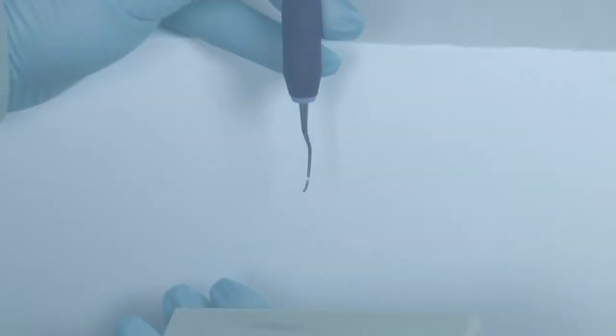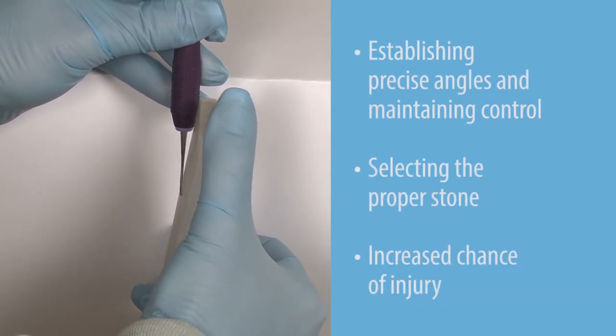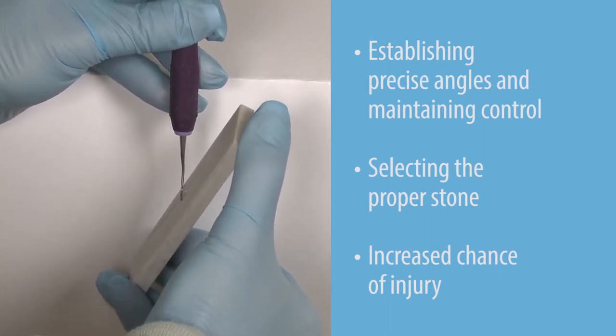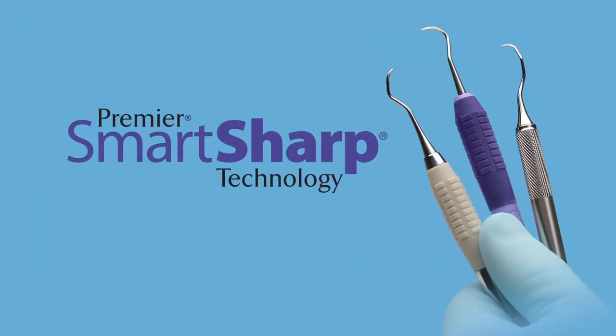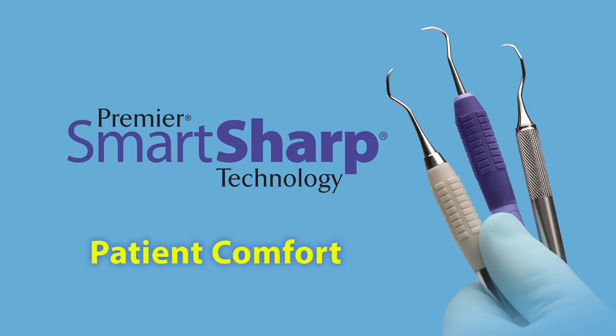Limitations when using a handheld stone include establishing precise angles and maintaining control, selecting the proper stone, and an increased chance of injury. Sharp instruments keep you at peak efficiency while minimizing physical stress. Your patients will appreciate an efficient procedure with greatest comfort to them.